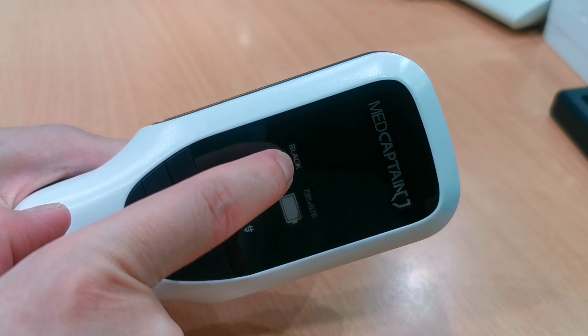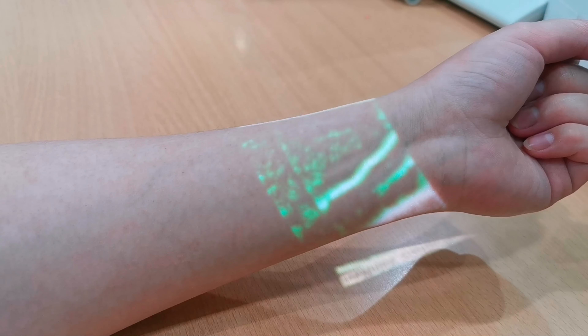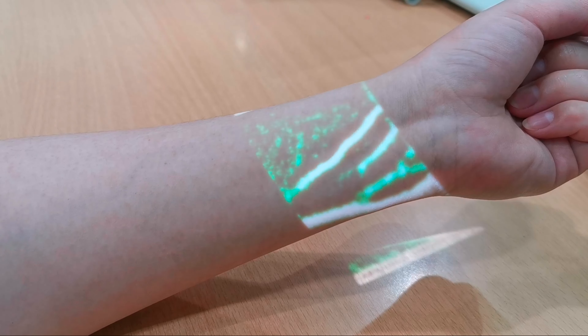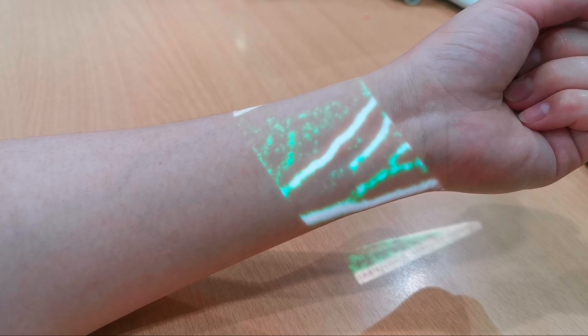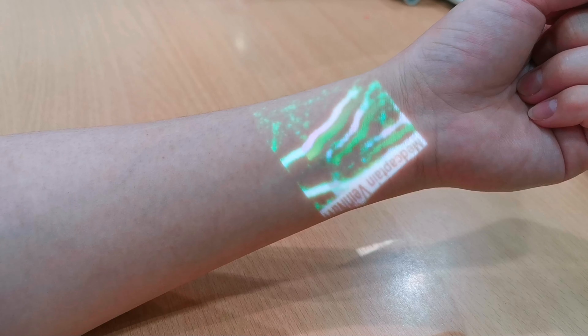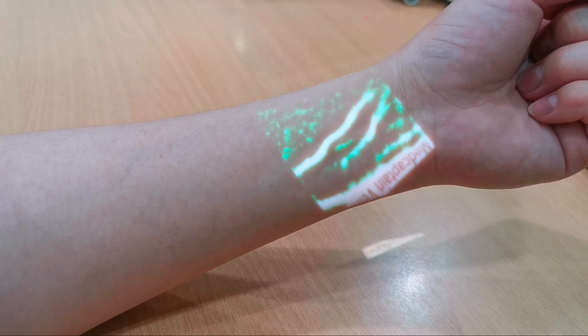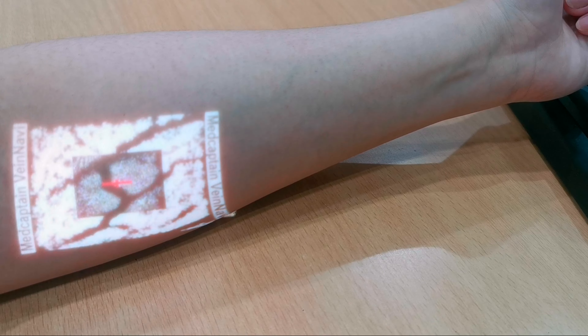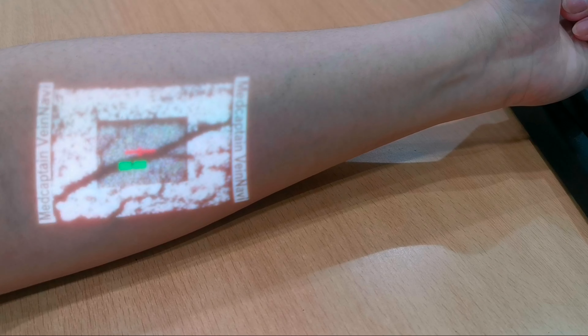Let's try it on my arm. Here you can see the superficial vein. Let's see if the device can detect it. As you can see, it detects the superficial vein. The color contrast is very good, and you can easily see the vein.